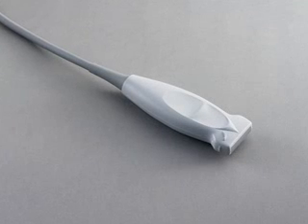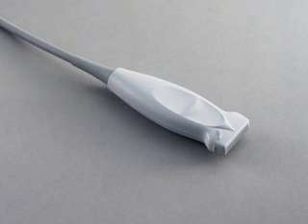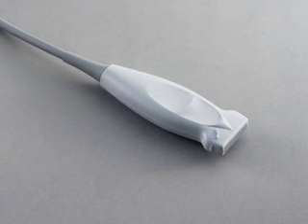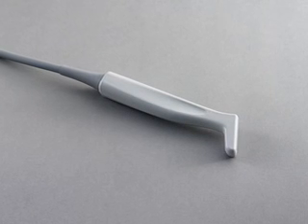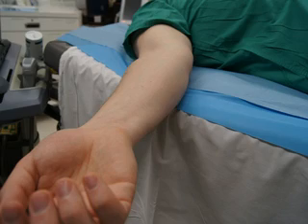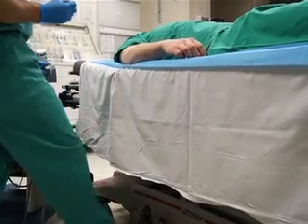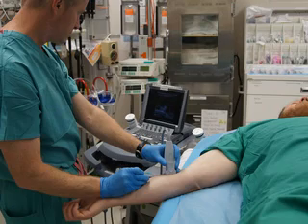A linear array transducer with a frequency of 5 to 13 MHz is usually used for ultrasound-guided vascular access. Short linear transducers are made specifically for ultrasound-guided procedures. It's best to place the arm in a horizontal position so the ultrasound images and needle movements are in the vertical plane. Elevate the bed or sit down so that you are not bending or stooping, but working with your hands comfortably in front of you. Place the monitor so you don't need to turn your head or look over your shoulder to see the ultrasound images.